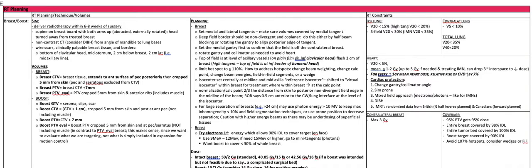For the boost volume, try electrons first. Use the energy that allows the 90 percent isodose line to cover the target en face. Use 9 MeV to 12 MeV. If you need 15 MeV or higher, go to mini tangents or photons. You want the boost to cover less than 30 percent of the whole breast.